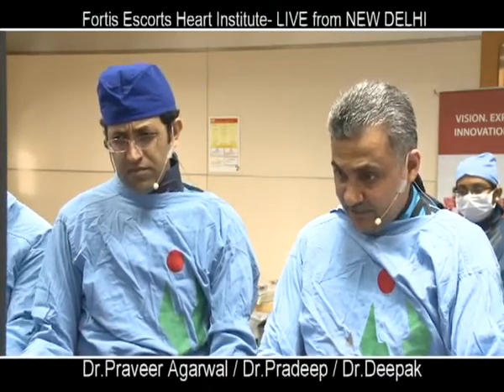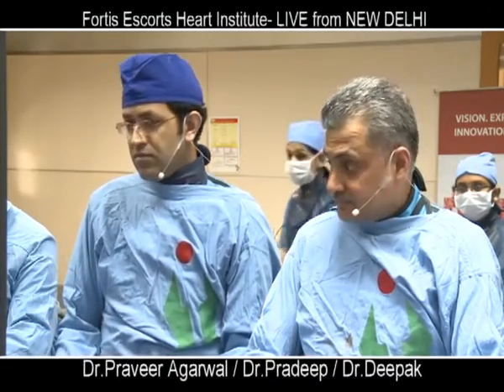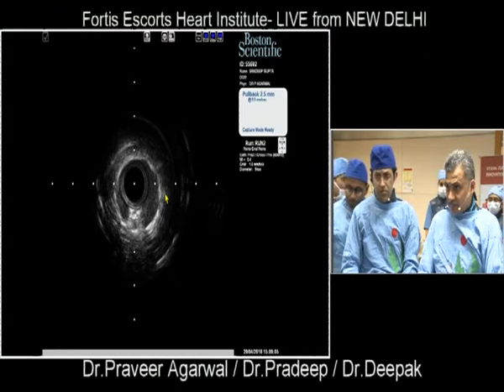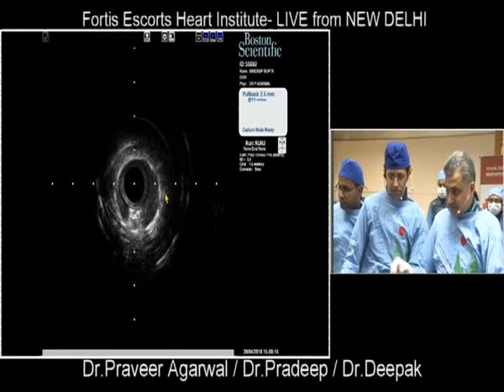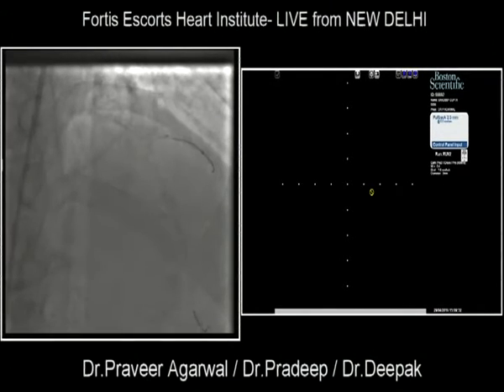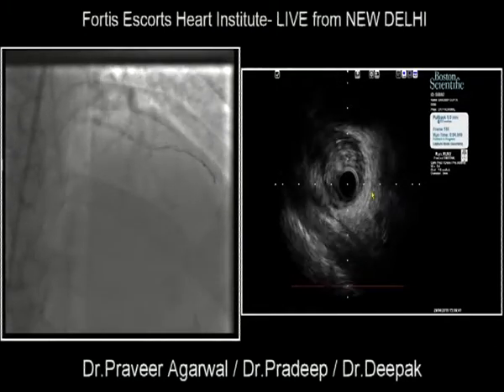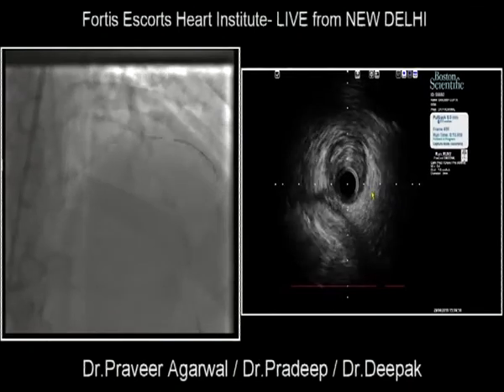One IVUS, please. IVUS on screen, please. I think that's enough because here it's a very short segment. Can we start, please? IVUS on screen, please. Start the run. Okay, shall I start? Yep. Yeah, so it's 2.5. Two in one dimension, maybe 3 in another dimension.